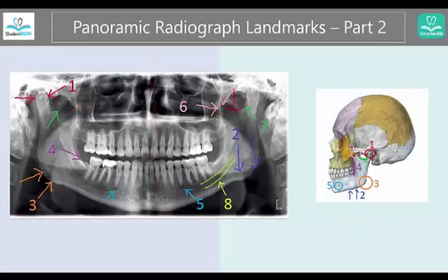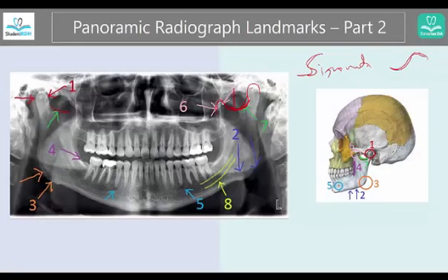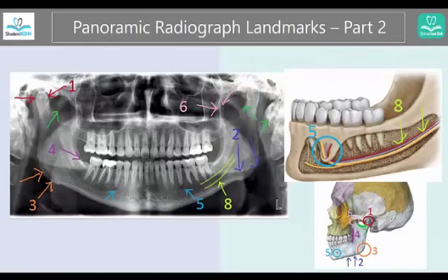Number seven is called the sigmoid notch. This is just between the condyle and the coronoid process — this dipping part. Take the 'S' and think about the curve, like you would have between the condyle and coronoid process. So you can remember this is called the sigmoid notch.